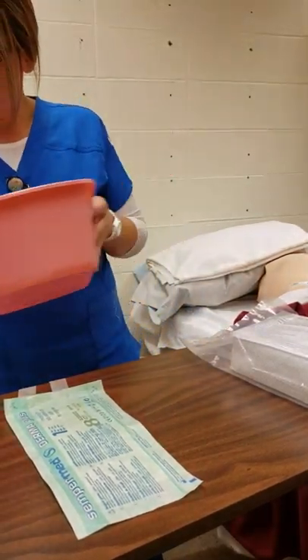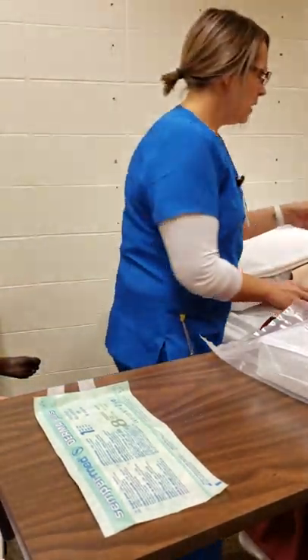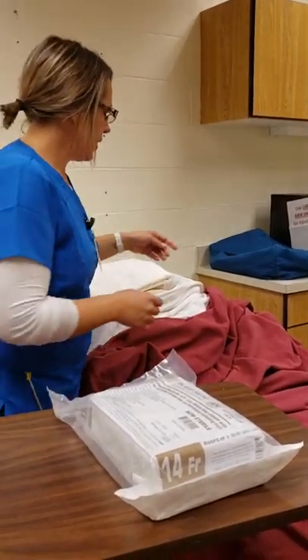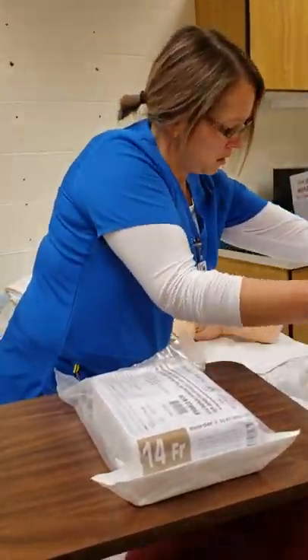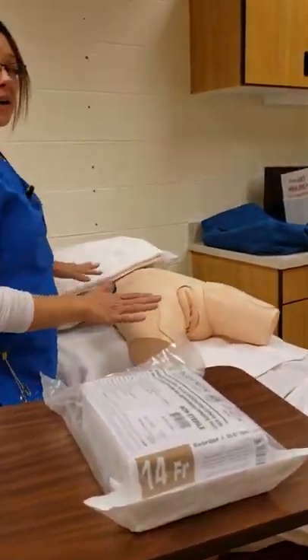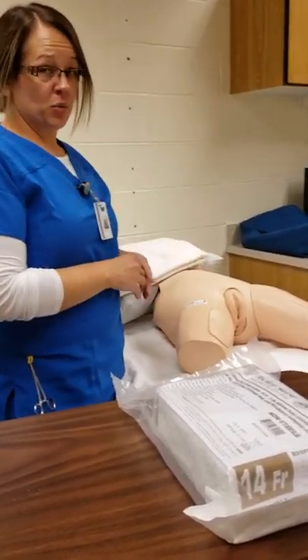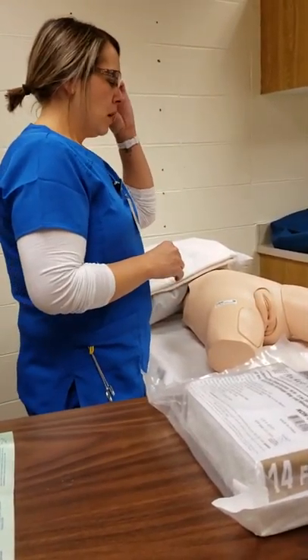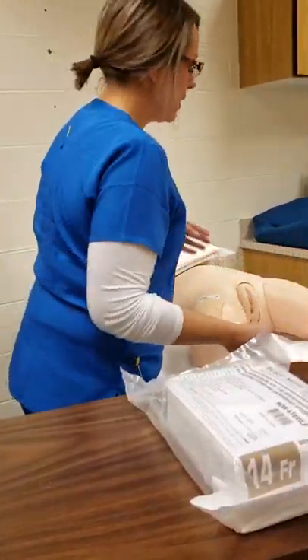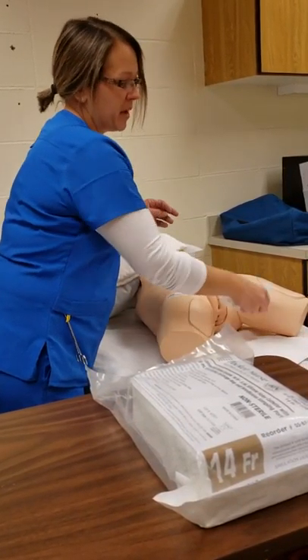I have a bucket of warm water with a washcloth and a towel. I would pull back the patient's sheets, make sure the bed is at the correct working height, side rails are down, and the patient is in the supine position. First I would grab my warm washcloth and perform perineal care, making sure to go from front to back, making sure the area is clean, then dry.